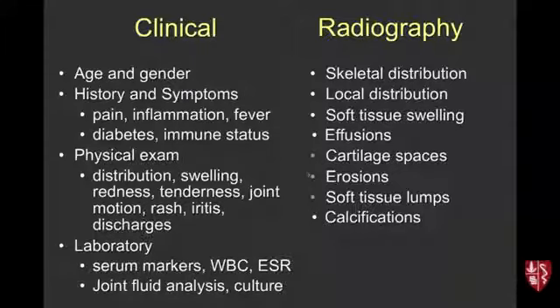The presence or absence of erosions, that's the key thing to bifurcate into something that's an inflammatory arthropathy versus non-inflammatory arthropathy. Are there soft tissue masses or lumps that might be present in rheumatoid nodules or gout, things like that, and any calcifications in the soft tissue. So when I'm looking at arthritis cases, these are the things that we're focused in on, and we have this as the backdrop, hopefully more of this than less, but that's basically the key background that I want you to take away.